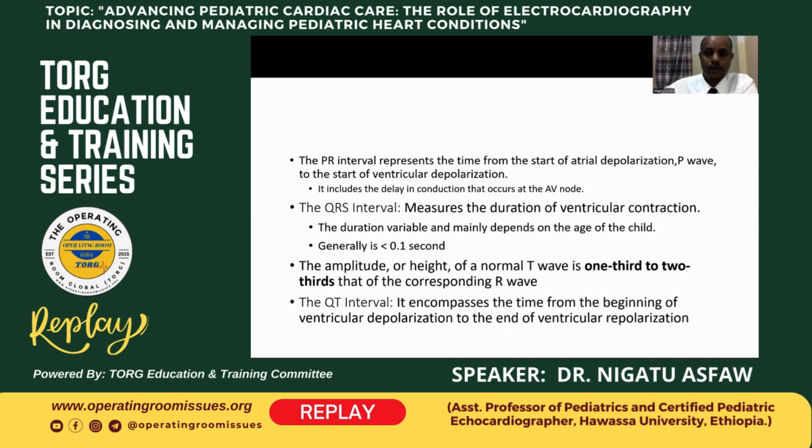So when we read an ECG, we need to see the intervals as well as the waves and the segments of the ECG display.